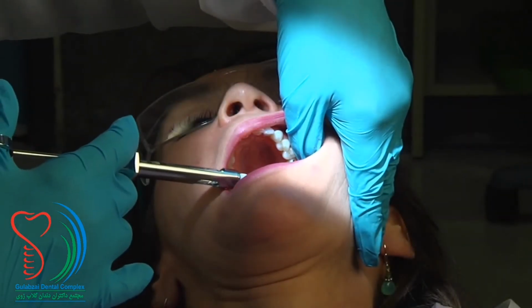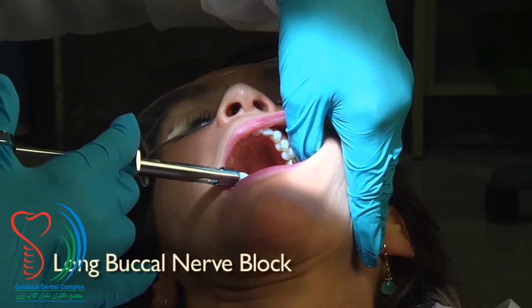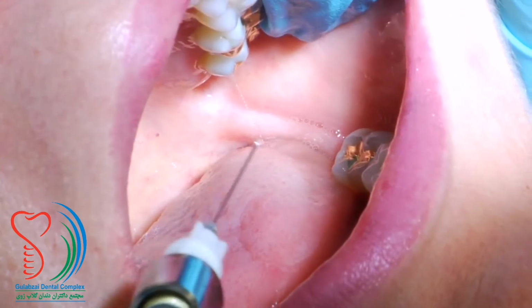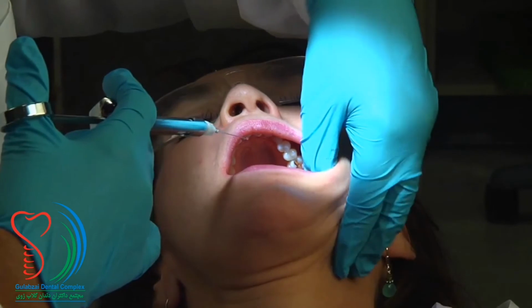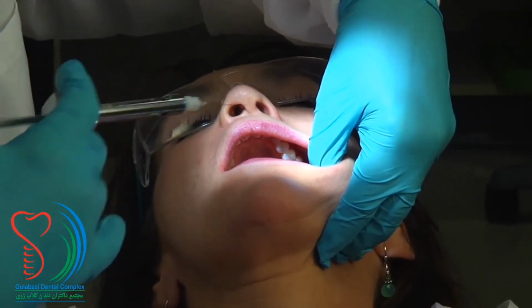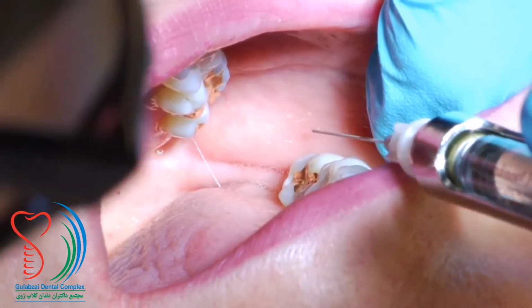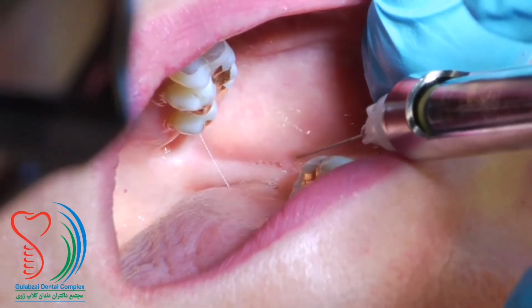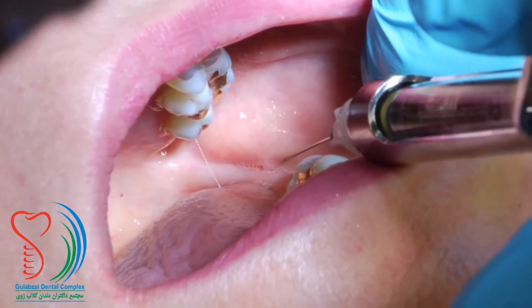So now that we've gotten the lingual and mandibular nerve anesthetized, the next injection to complete the mandibular block is the long buccal nerve block. Withdraw the needle from the injection site. Reposition your thumb more laterally to the outer limit of the coronoid notch, keeping the tissue taut. Insert the needle into the tissue on the ascending part of the ramus, distal to the last molar, parallel to the occlusal plane, and lateral to the buccal cusps.